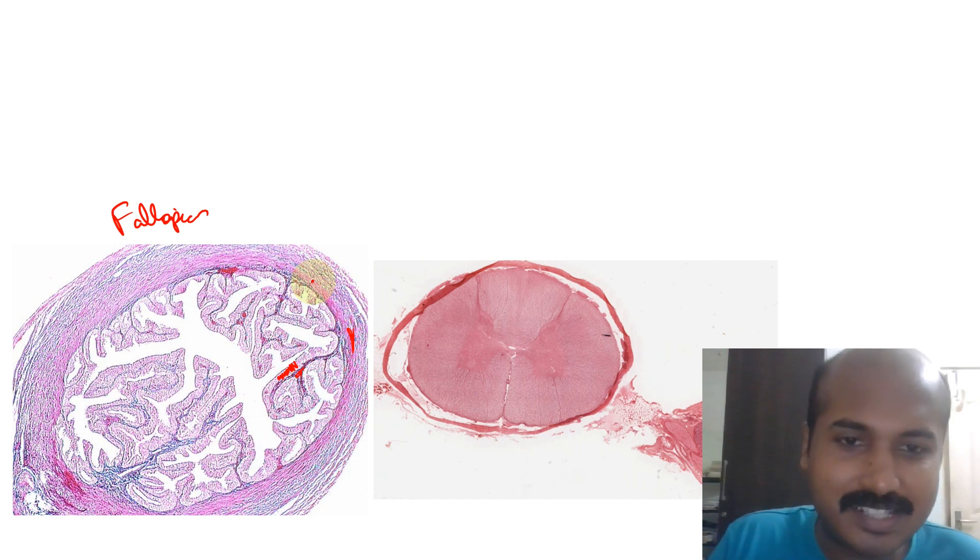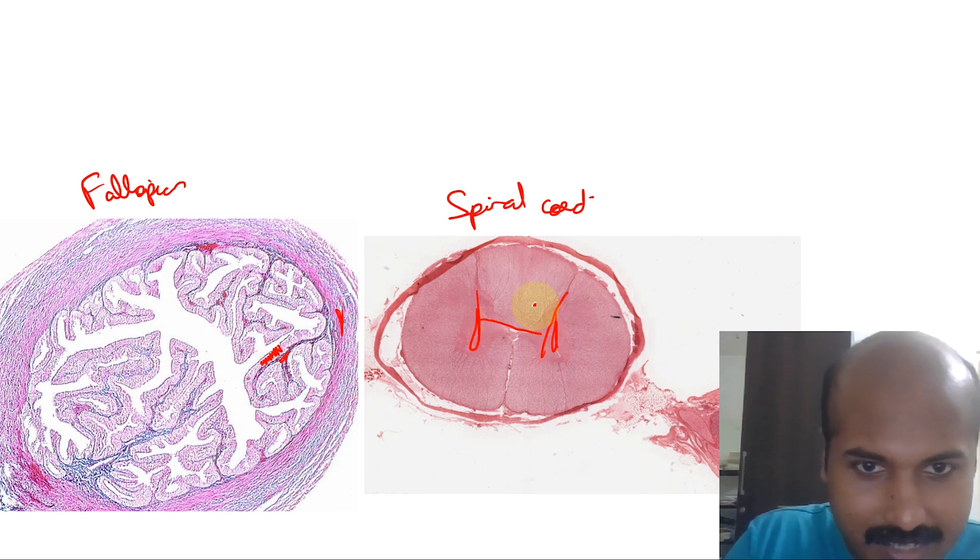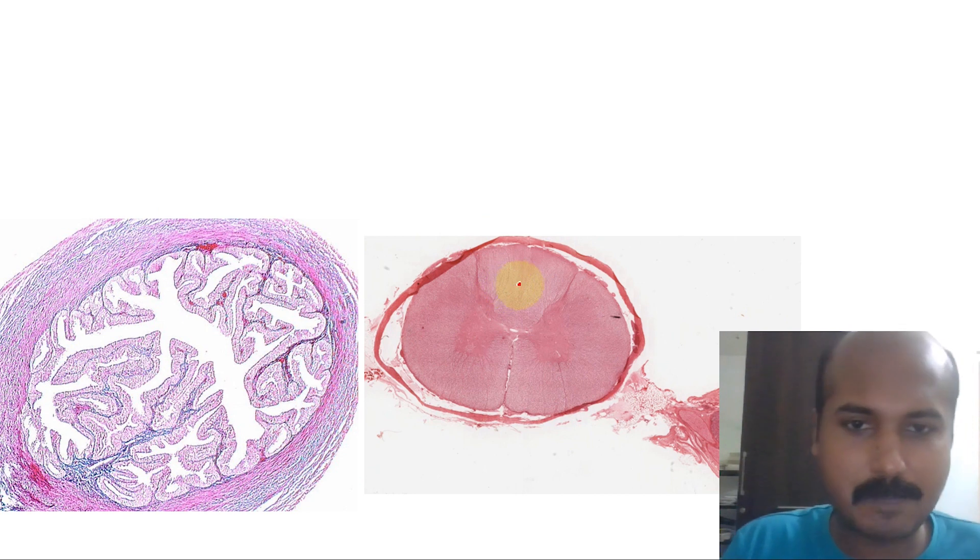Now this is another tissue. Here what you're seeing is a spinal cord. Why I say this is a spinal cord: you can see an H-shaped gray matter and a more pale or white matter around it. That is a typical arrangement of a cross-section of a spinal cord.